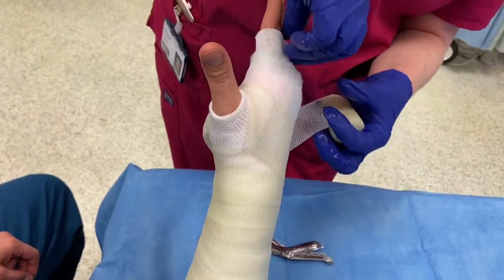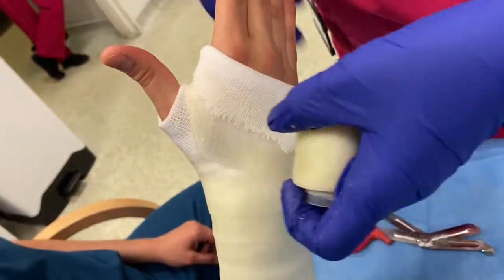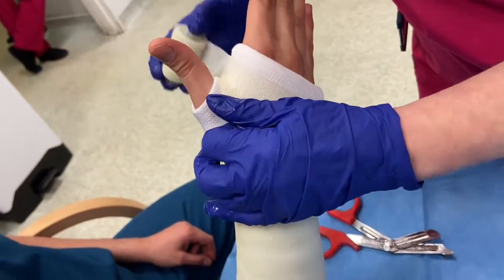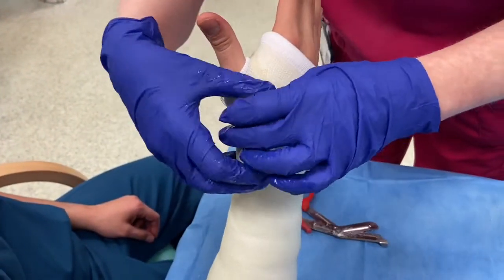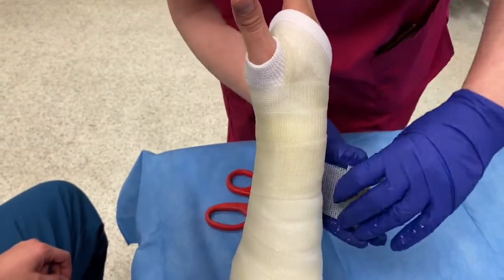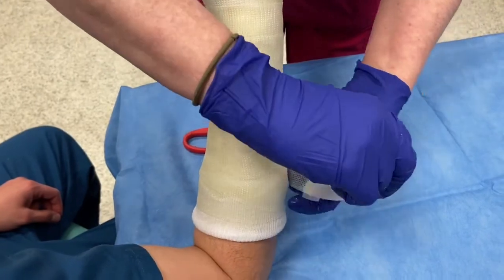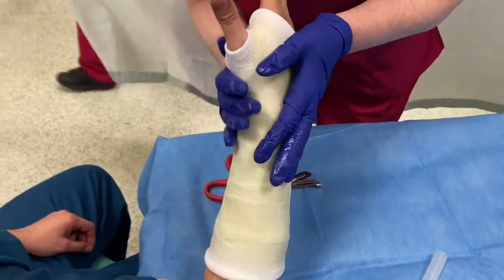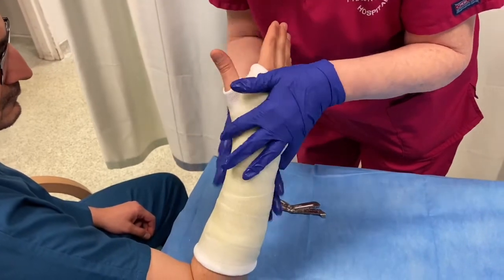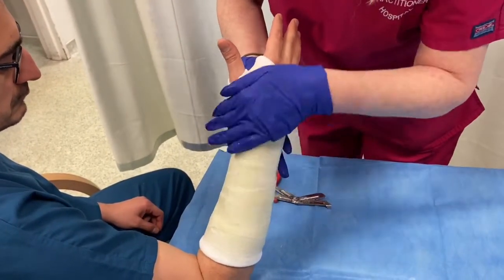The particularly tricky part of casting with fibreglass is working around the hand and the thumb, and it takes a lot of practice to make it look this easy. If you've made the mistake of using warm water, by the time you get to this point the cast is already setting and it's impossible to manage. Once the hand has been done, the rest of the casting material is continued back down the forearm towards the elbow, completing a second layer, overlapping by 50 percent each time. Once the cast has been finished, there is the opportunity for some quick moulding around the fracture site, and then by rubbing the cast it smooths the fibreglass. Sometimes soap or KY jelly is used as well, which makes the final product a little bit smoother on the skin.